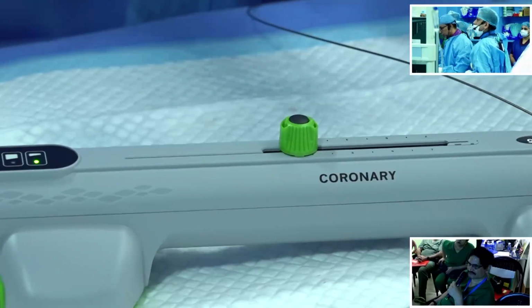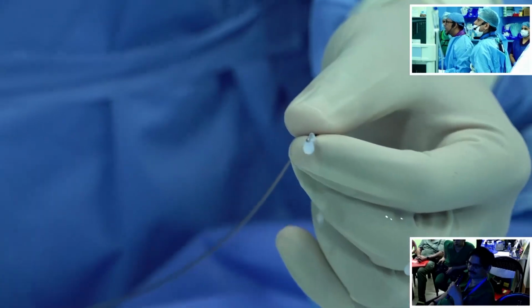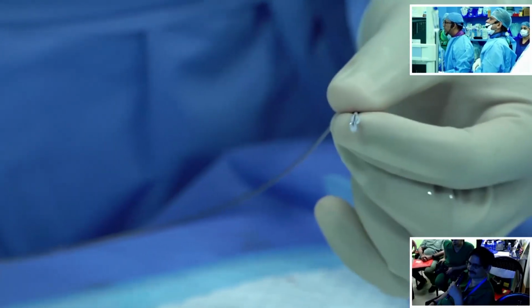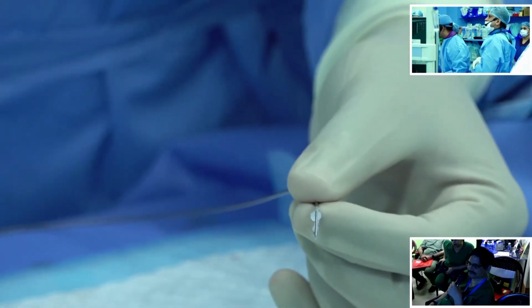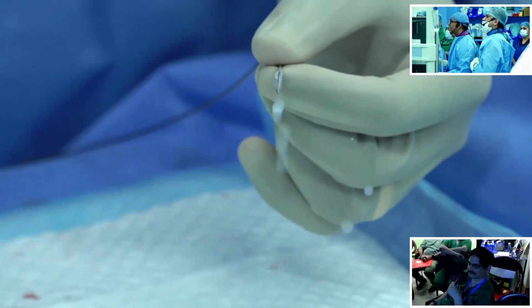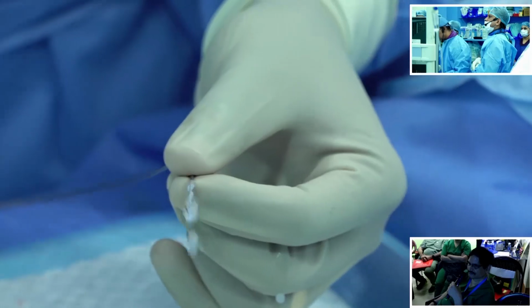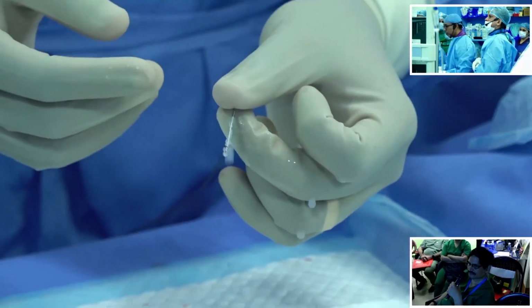Okay, so here we have the saline. We do not have to adjust the drip rate like what we do for the rotablation. Basically you just have one speed and it just comes over like that. Every minute around 16 ml flows through this catheter, so that it just washes away whatever debris is formed inside the vessel.